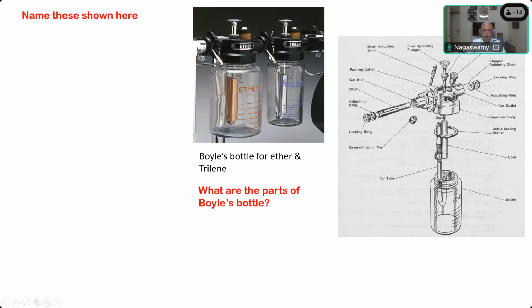And can you use both these vaporizers at the same time? No, sir.